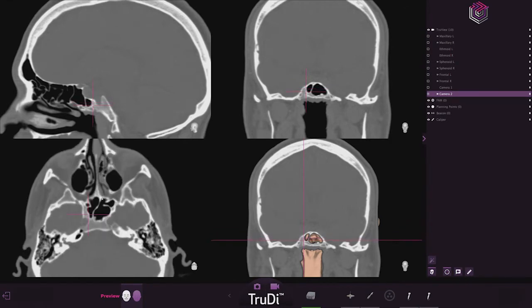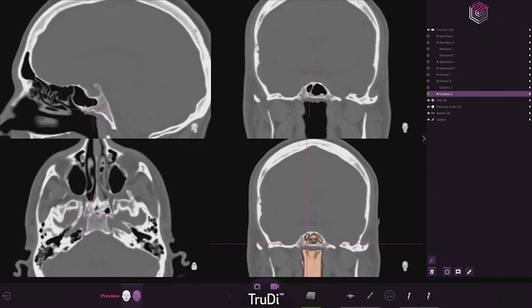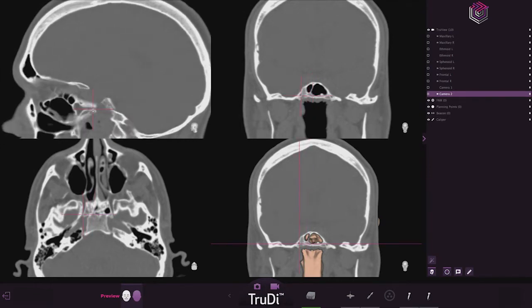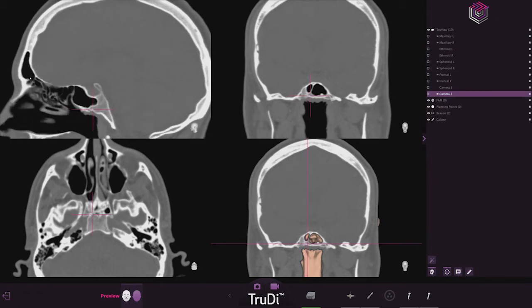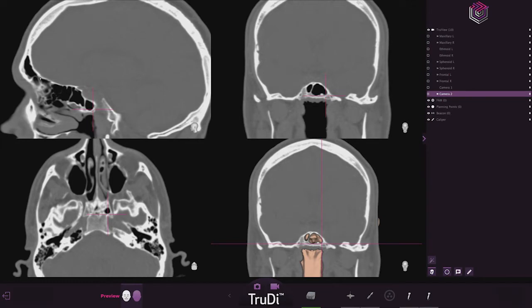Then, of course, the sagittal cuts are particularly helpful for the anatomy of the frontal recess. So starting on the right, working towards the left, we can see what looks to be a frontal sinus tract there. And as we approach the other side, it looks like there's a fairly prominent Agger nasi cell here. There's probably the frontal sinus tract, and that's where we'll probably have to access things, right between the skull base and the top of what I suspect to be an Agger nasi cell.